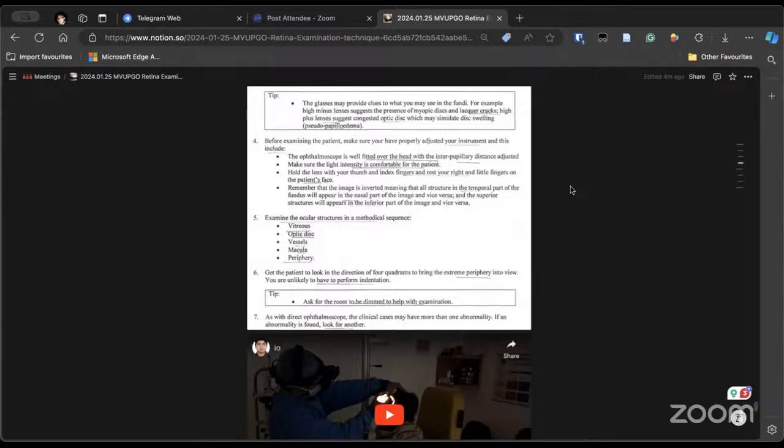So I am giving you a scenario. A patient is complaining of flashes and floaters, and in the vitreous you are seeing some pigment dot-like things. So what is its significance? These pigments are Schaffer's sign, yes. There might be retinal detachment or even a retinal break.